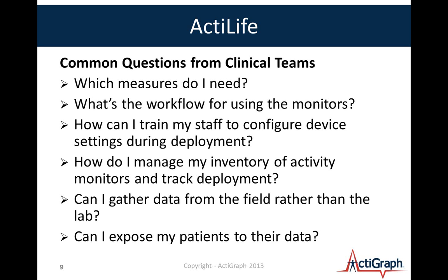I've got a box of ActiGraph devices. How do I put them into action? What's the first thing I do? How do I train my staff to configure these devices and deploy them? That's always a question we get, because you as a user, you realize and know that these devices are little computers, and they're not simple black boxes, and so it takes a little bit of learning to understand what you're doing with the device. And then how do I manage inventory? I mean, some of our customers have thousands of these, and how do they manage them?